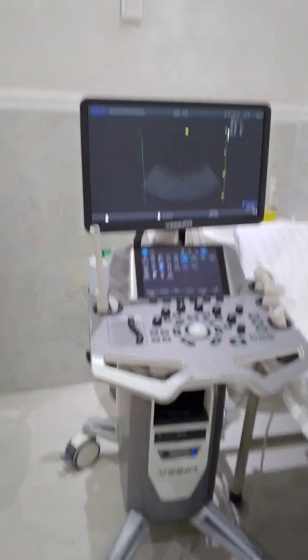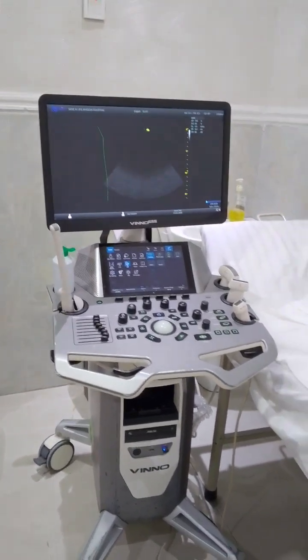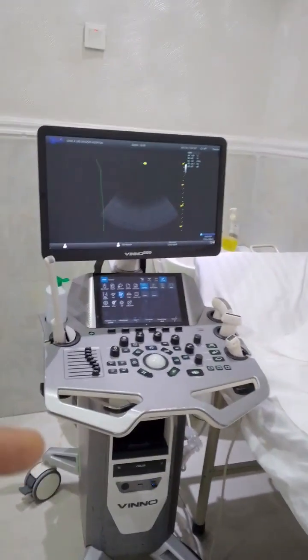I mentioned yesterday that I would be introducing you to the ultrasound machine today. So as part of our What is Ultrasound series, we're going to introduce you briefly to the ultrasound machine. Alright, here we go. An ultrasound machine usually consists of a monitor like you're seeing here.